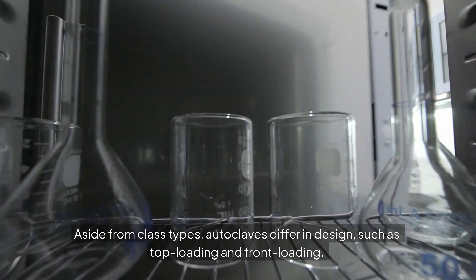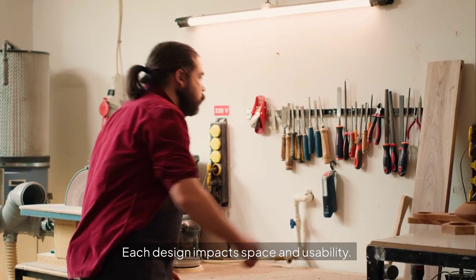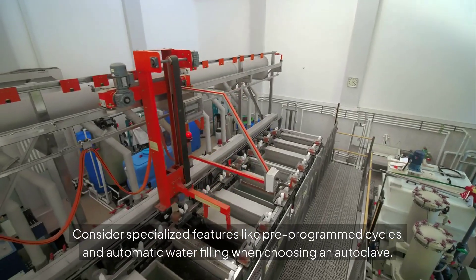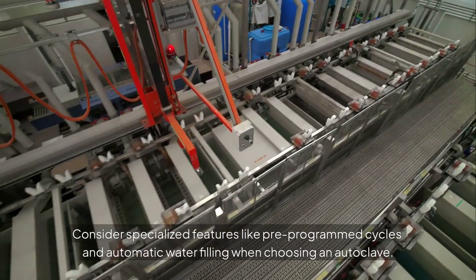Aside from class types, autoclaves also differ in design, such as top loading and front loading. Each design impacts space and usability. Consider specialized features like pre-programmed cycles and automatic water filling when choosing an autoclave.